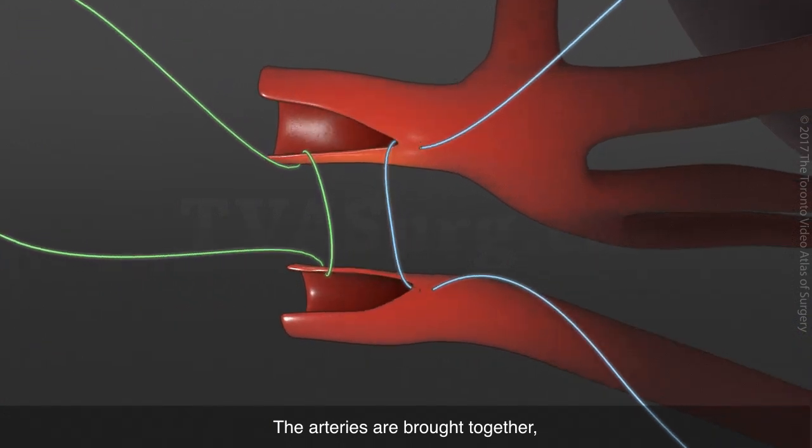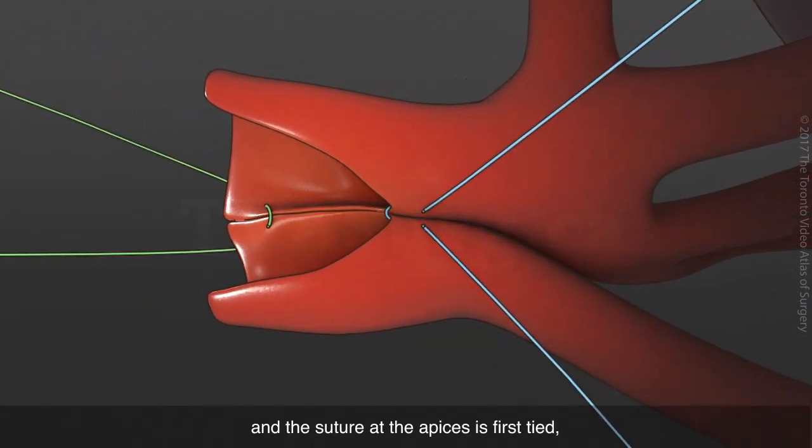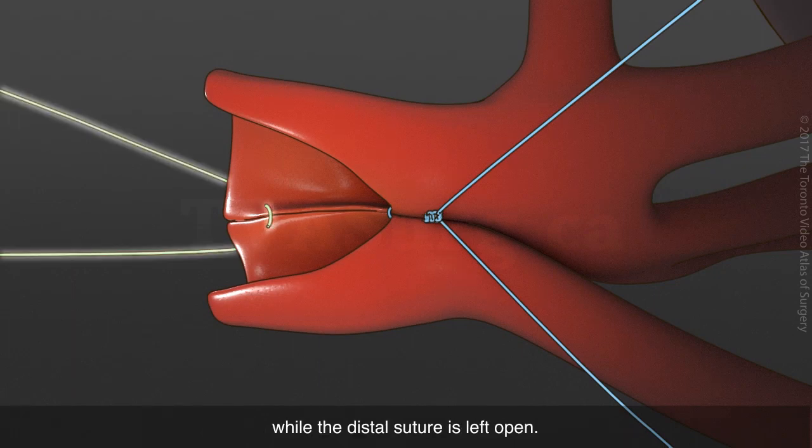The arteries are brought together, and the suture at the apices is first tied, while the distal suture is left open.